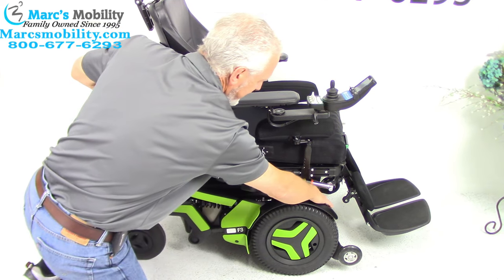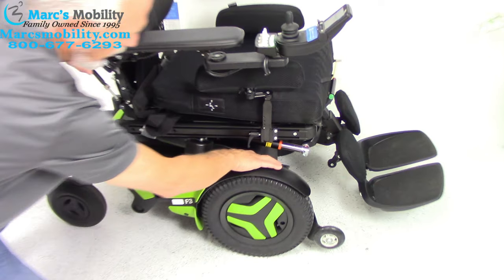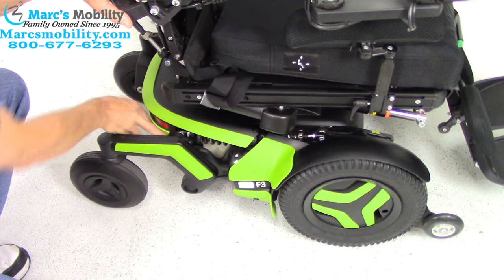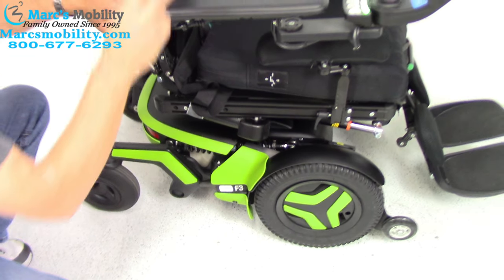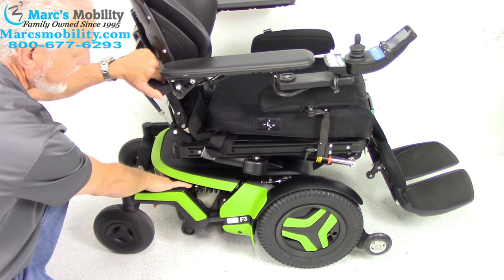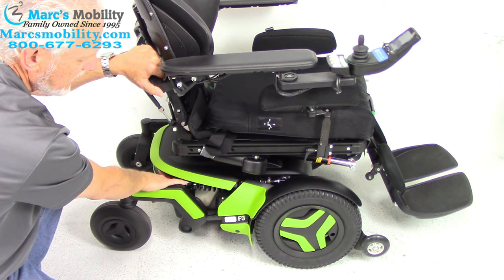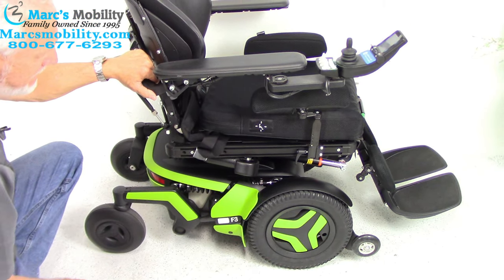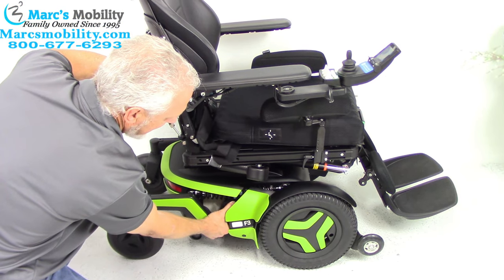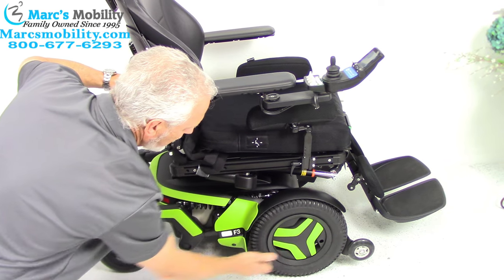You have an anchor point right here inside the chair — you can see it. There's another one behind the frame over here. There are two anchor points on each side, a total of four anchor points. This is where you would tie your chair for shipping or for transporting on your lift or in your van. You also have a motor right here — you can see the end of the motor where it goes right to the wheel.